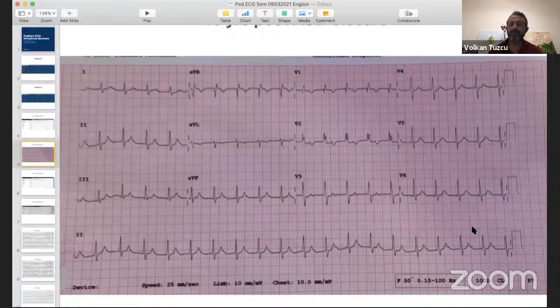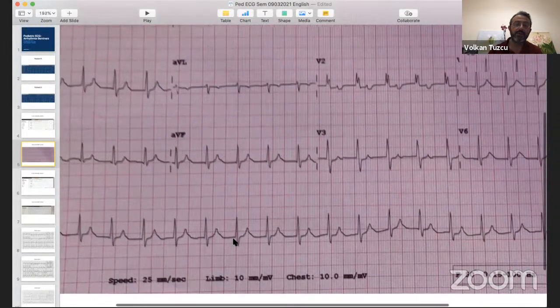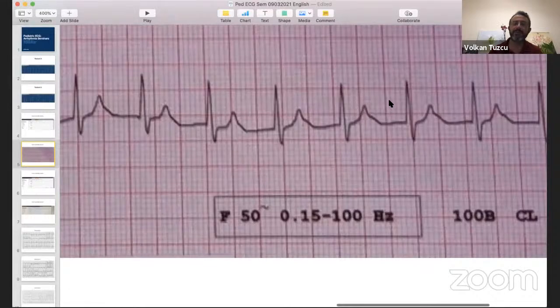First of all, yeah, okay. Some people are now starting to say there are P waves on T waves, and actually it's true. If I zoom, look at the T waves, there's a relatively peaked T wave. This is not a normal T wave configuration. Whenever you see something really sharp on a T wave, always be suspicious for actually a P wave, okay?